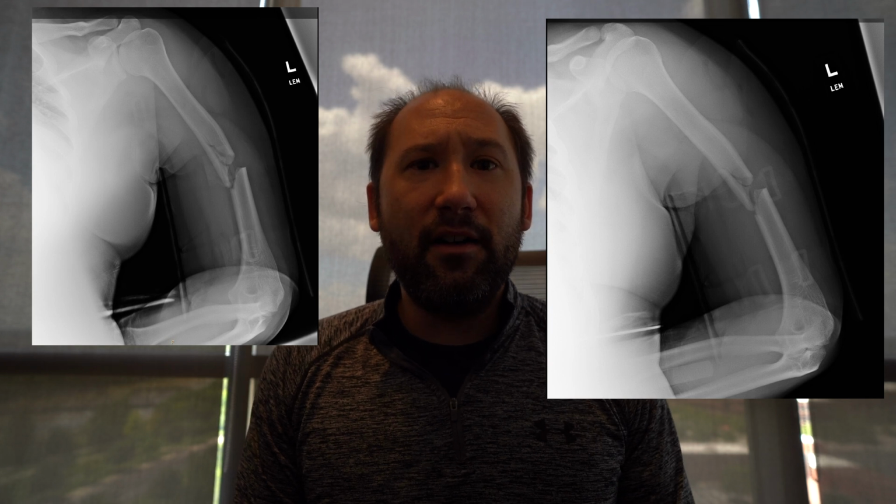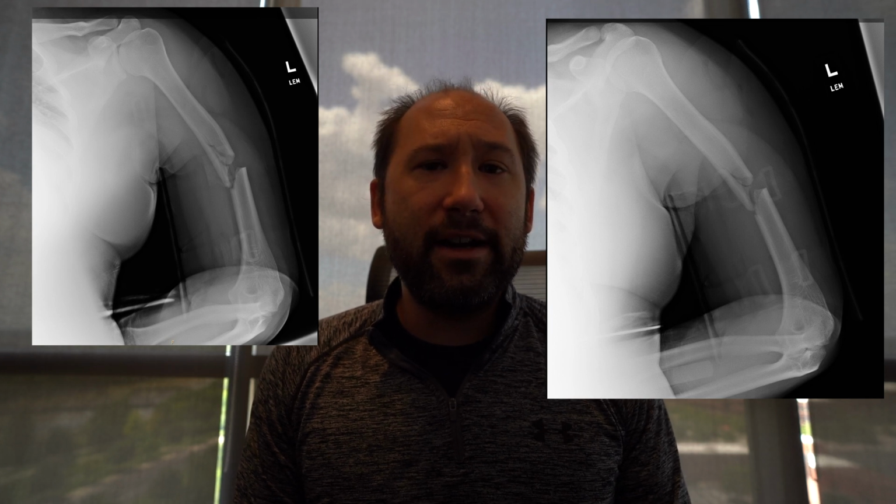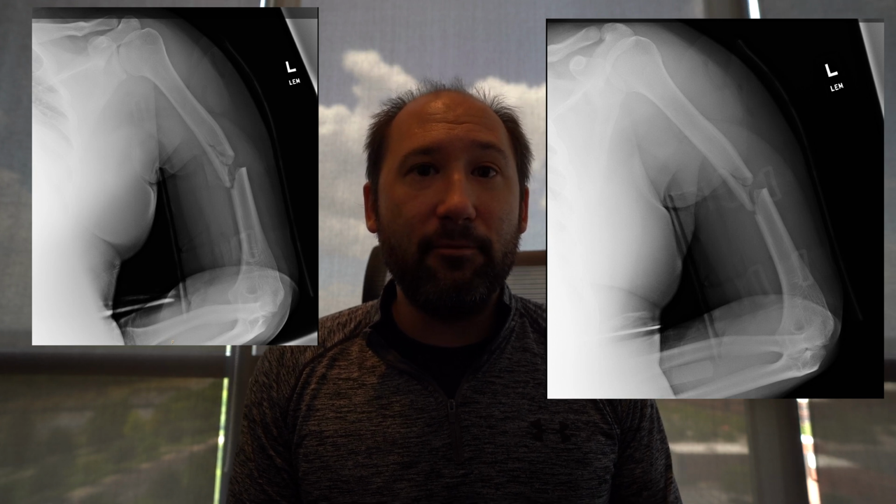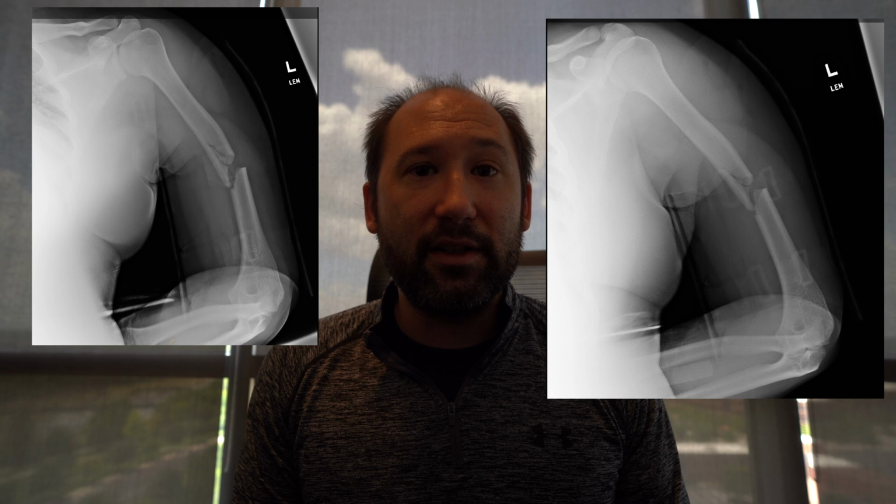In terms of varus valgus or anterior-posterior angulation, this fracture is actually within good tolerances. However, the large distraction at the fracture itself here is what I would say is the most concerning part of these radiographs. Certainly we're far outside of the jumping distance of osteoblasts and the potential for healing of his fracture. So we had a long conversation with him about that.